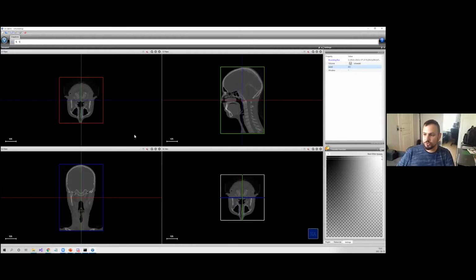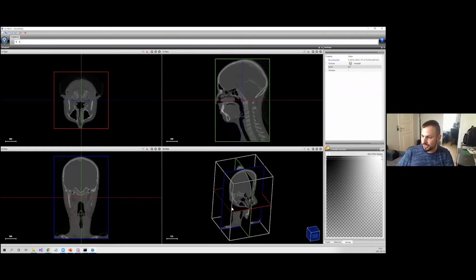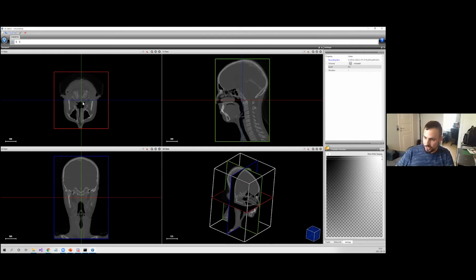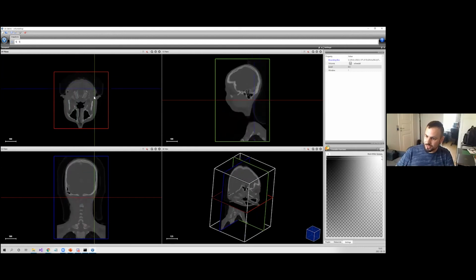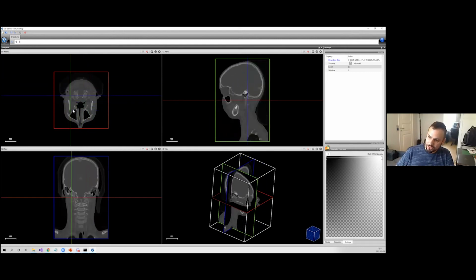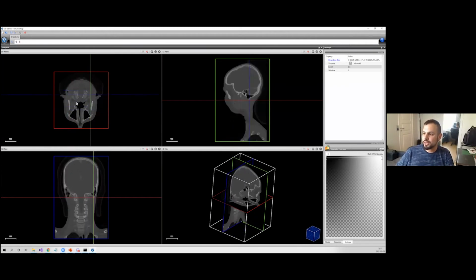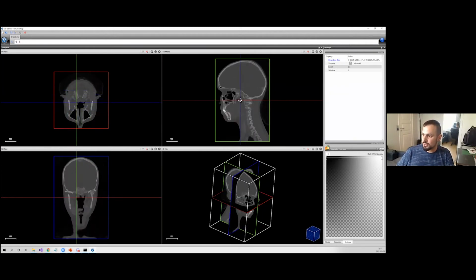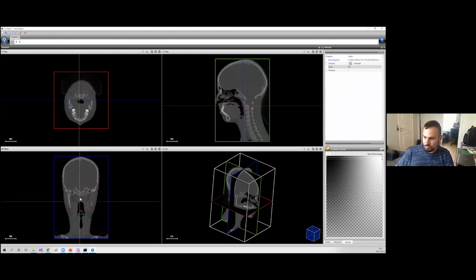So here, this would correspond to a typical MPR setup. You see, I have the three main axes here, and here I see the slices in a 3D view. Now you can see that if I'm moving this cursor here, the other two slices move, essentially moving the intersection point between those three slices in 3D, such as this.